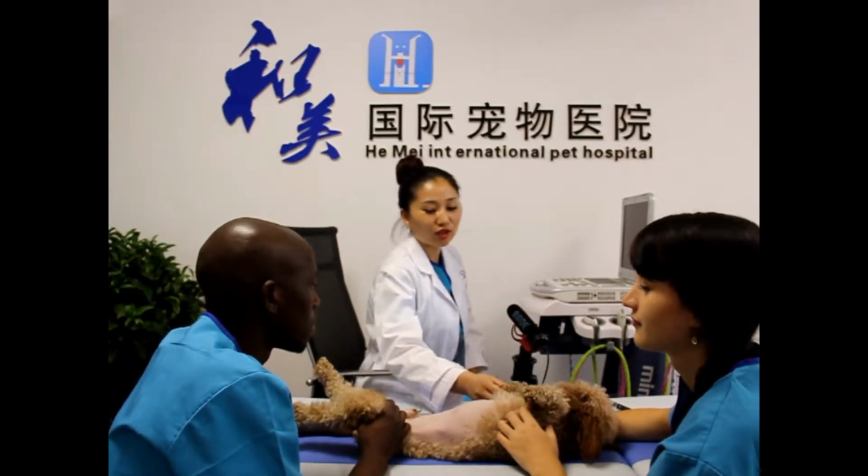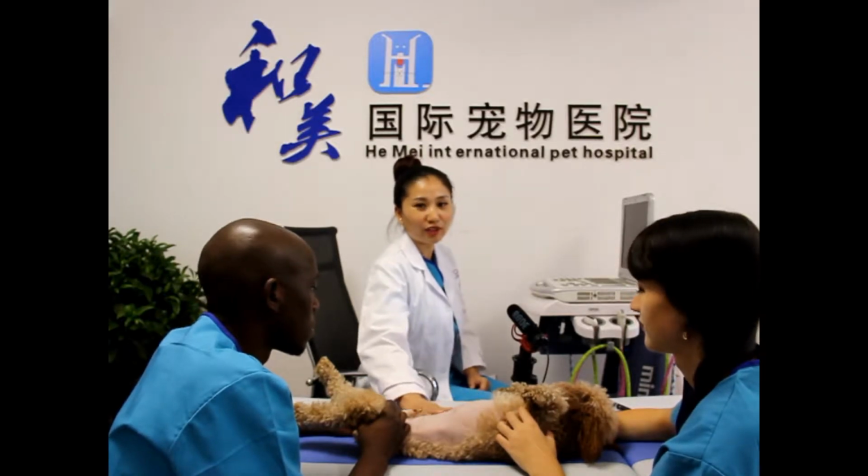Ultrasound is a machine that we have in many pet hospitals, so today we will talk about how to do adrenal glands ultrasound. Now, I will use this cute dog to show you how to find the adrenal glands.